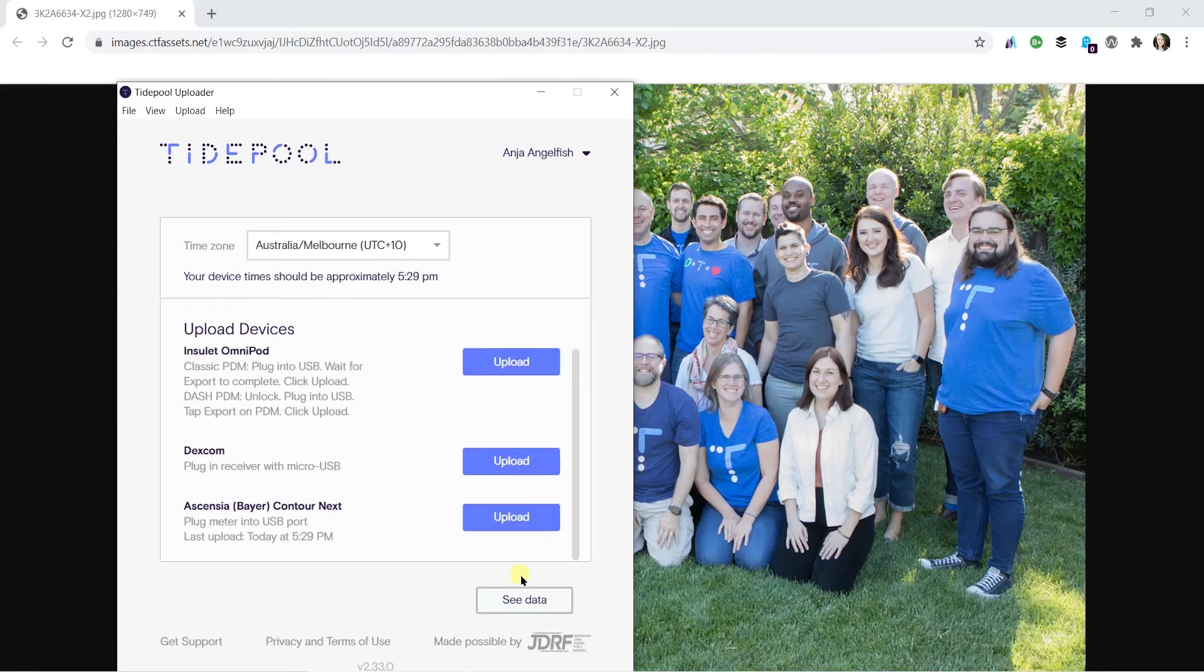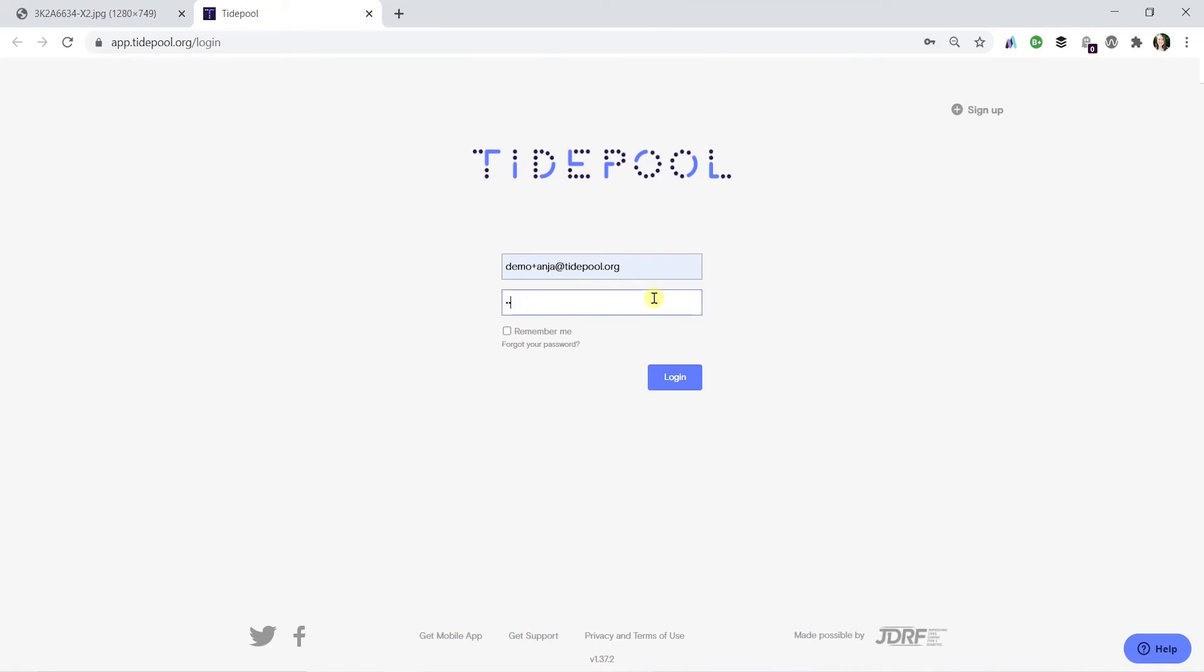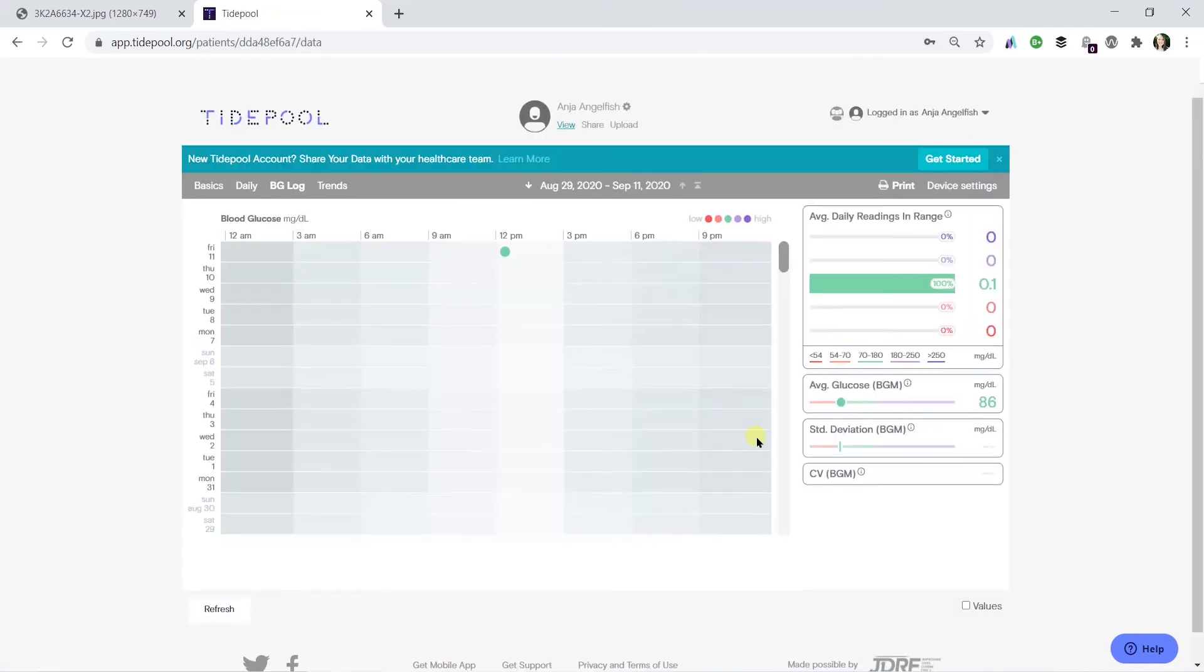Now your data is ready to view across Tidepool's platform of tools. Congratulations on your first upload with Tidepool!